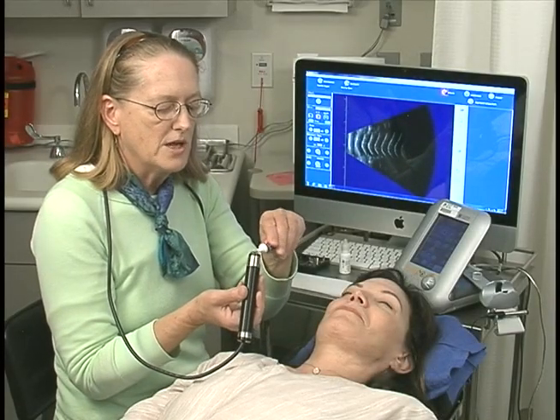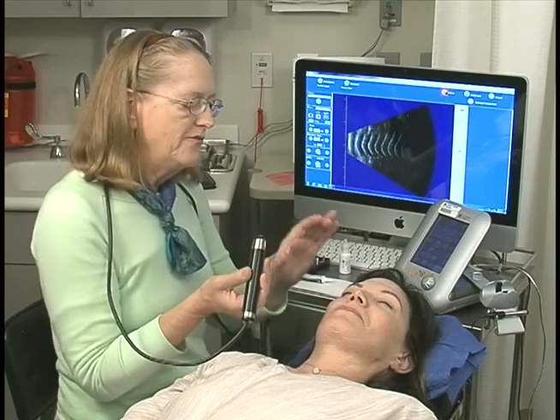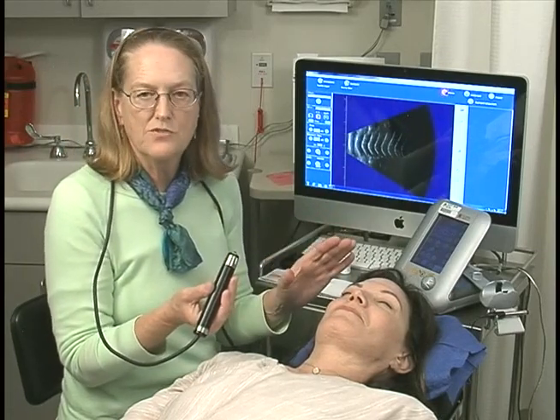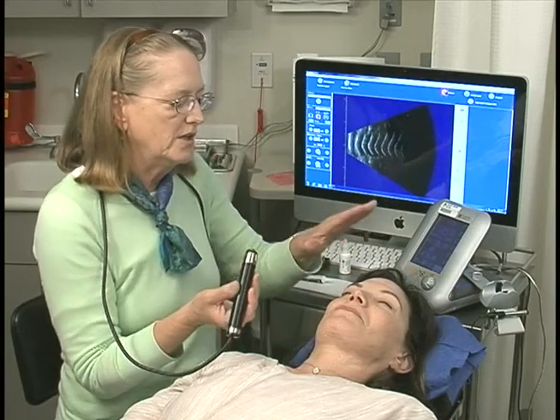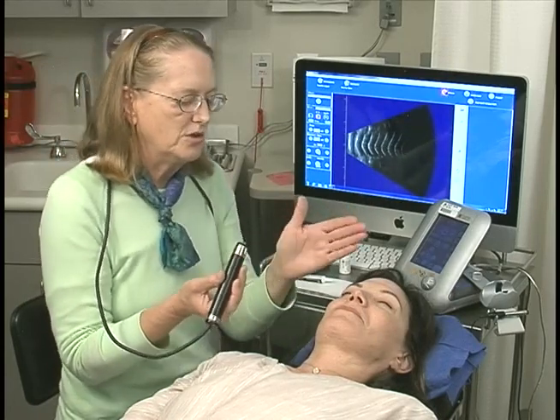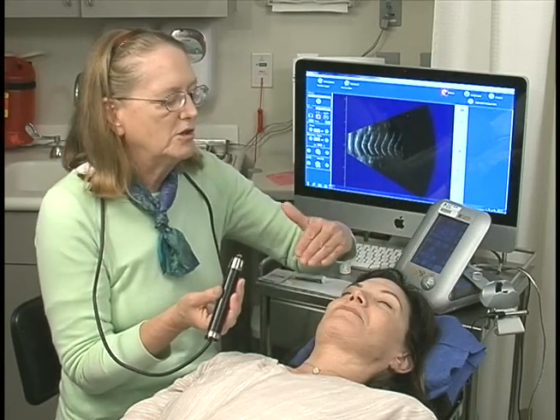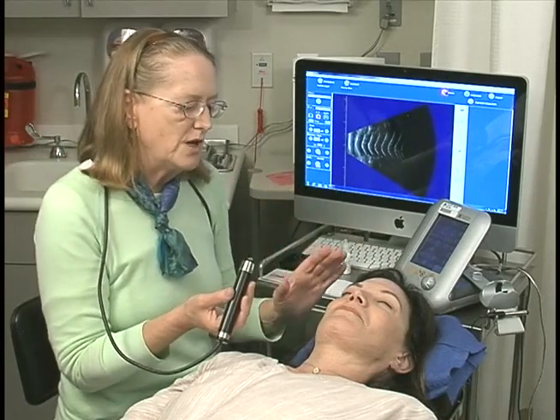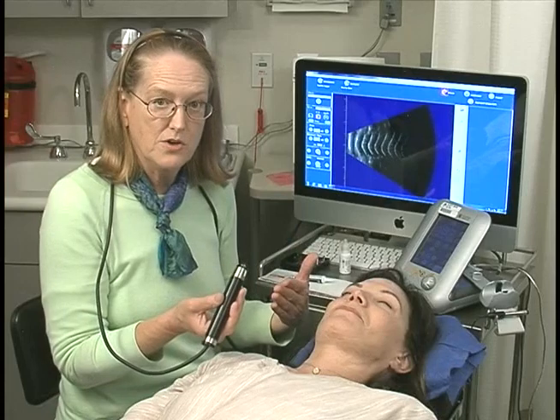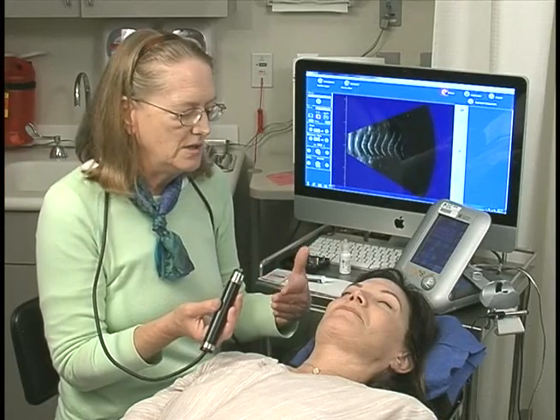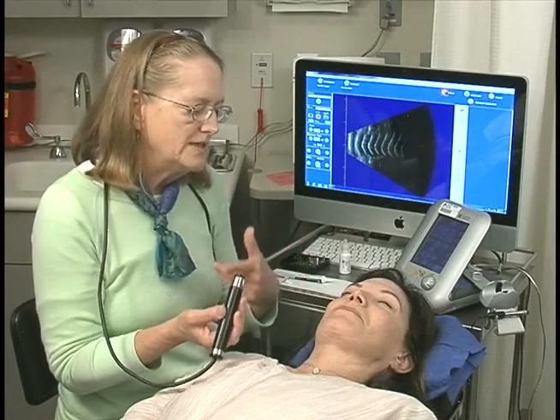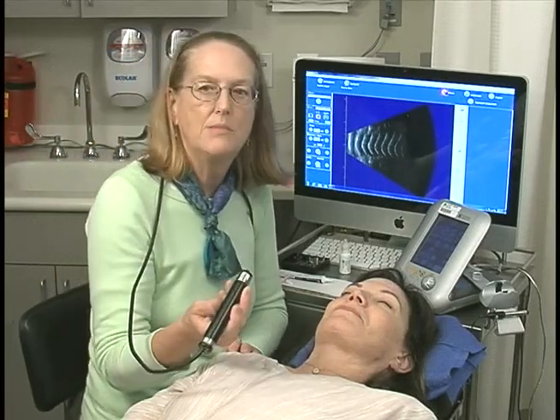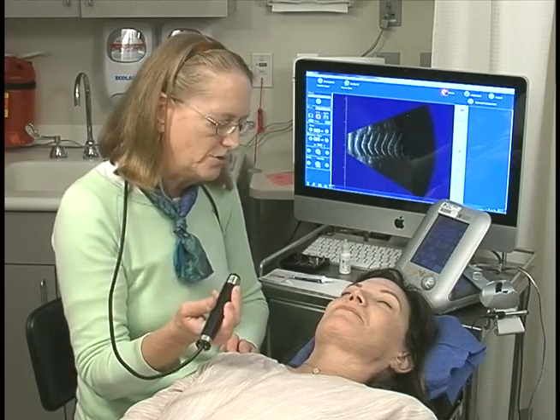I'll add a little bit more gel. When I've finished the four basic quadrant transverse scans — the horizontal looking superiorly, horizontal looking inferiorly, vertical looking nasal and vertical looking temporal — there might be a situation where you need to do an oblique transverse in order to center the pathology in the image. I'll do an example of an infrotemporal because in oncology we see melanomas so frequently infrotemporally.